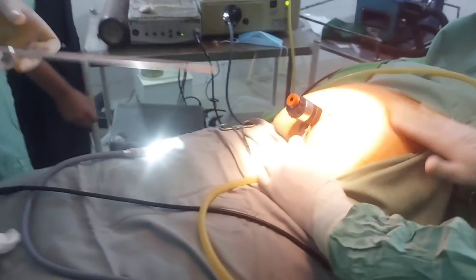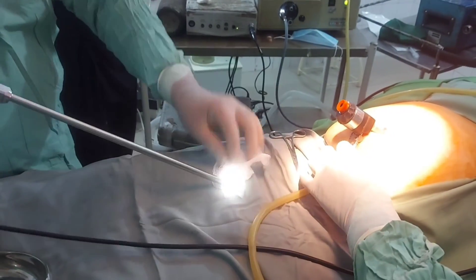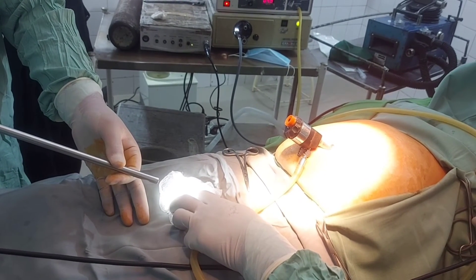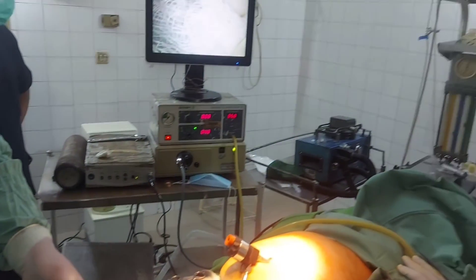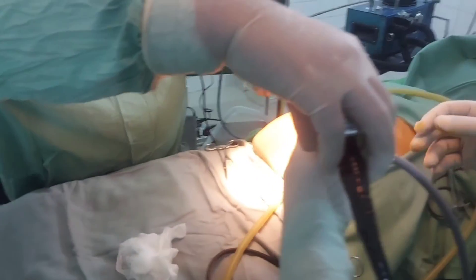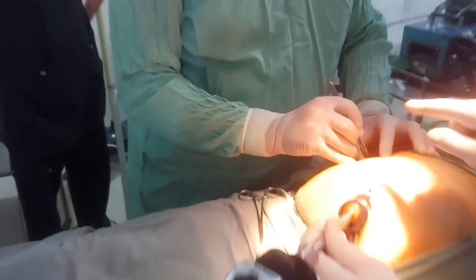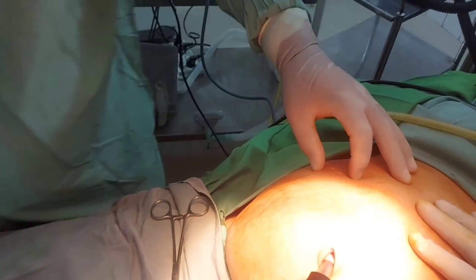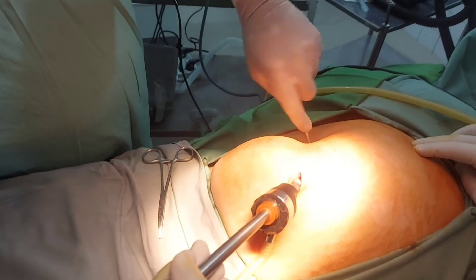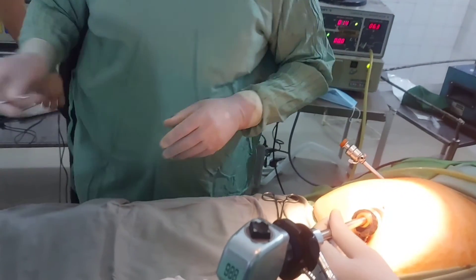The light source is attached to view the area in the abdomen. Settings are done and before passing the laparoscope into the abdomen, white balance is maintained — as you can see on the monitor, white balance is okay. After passing the laparoscope, the second port — a 5 millimeter port — is passed in the right hypochondrium region, used for handling, manipulation, and retraction of the gallbladder. The laparoscope is used as a guide to pass this port.